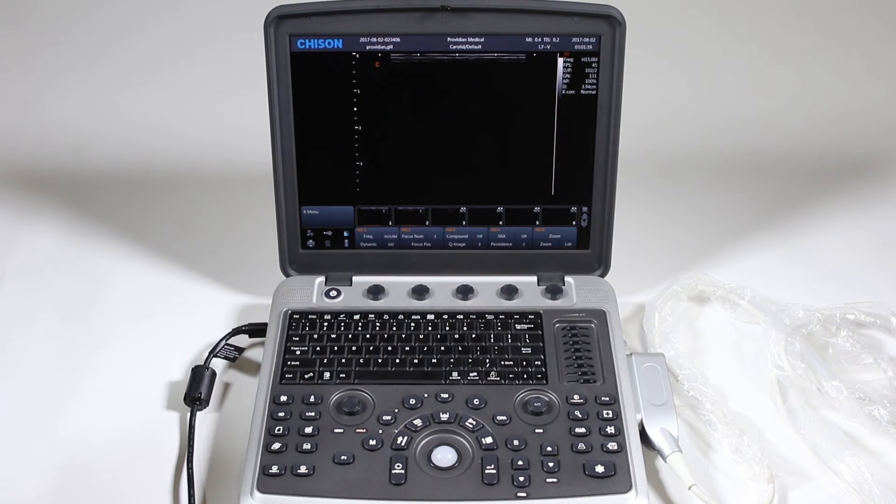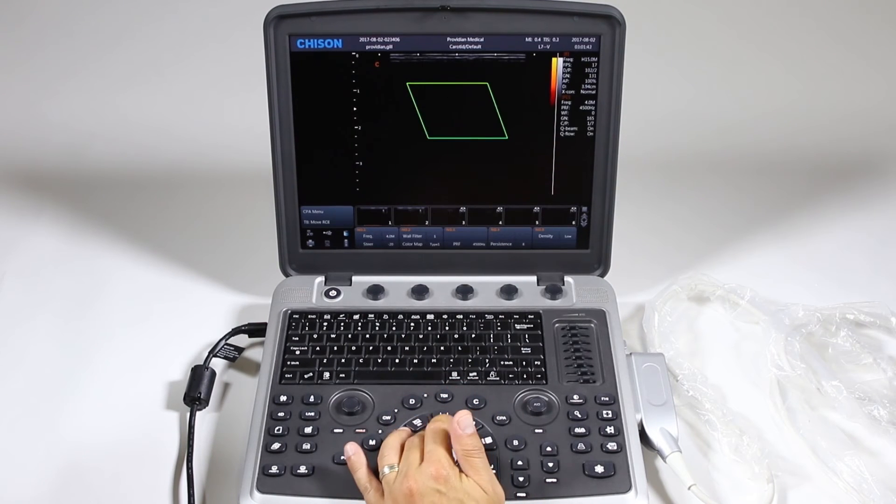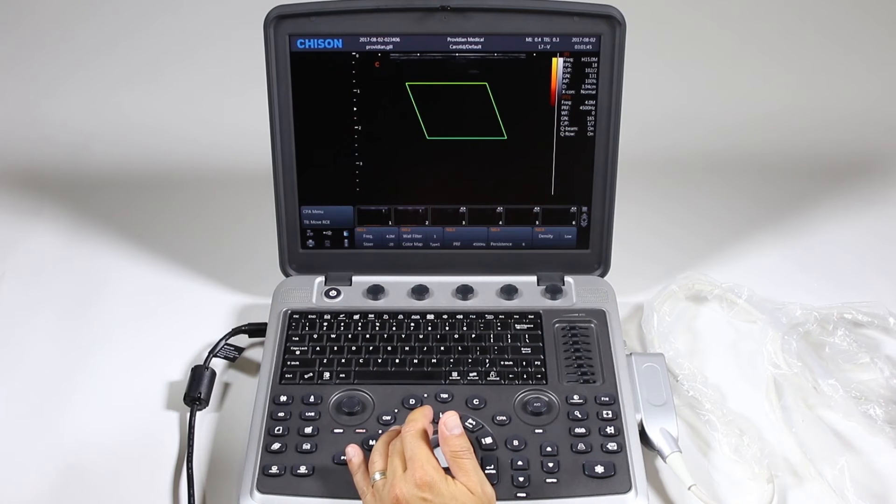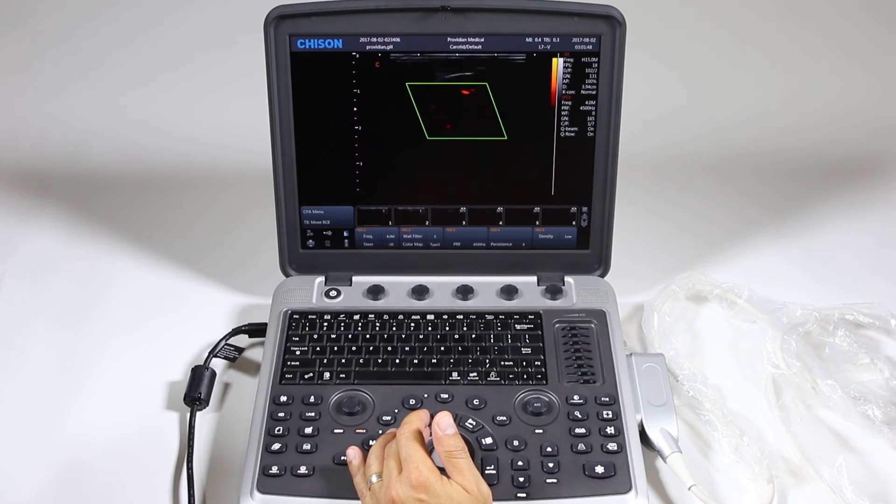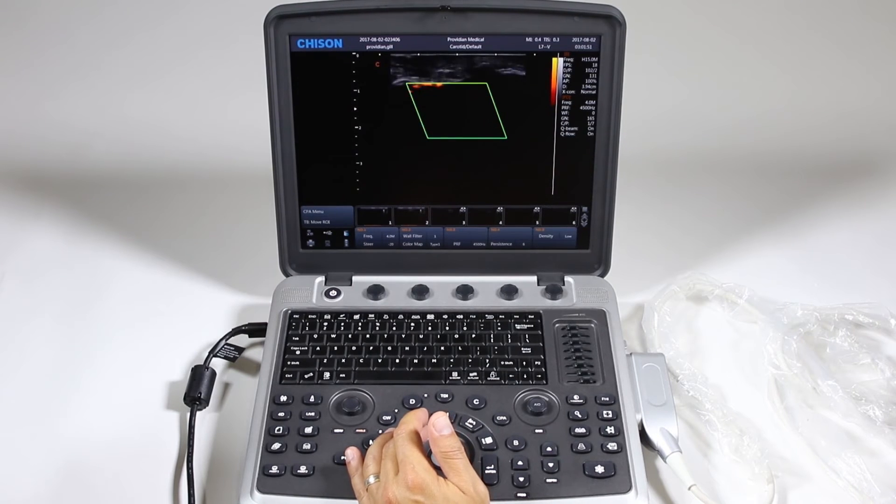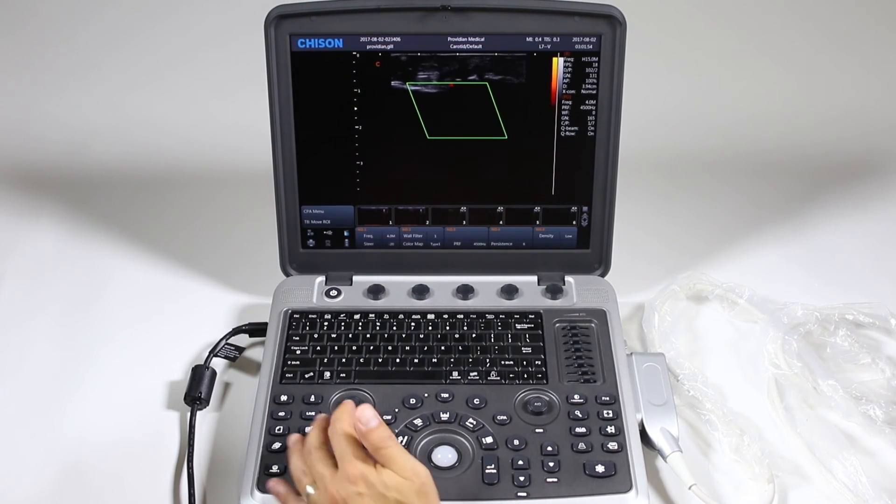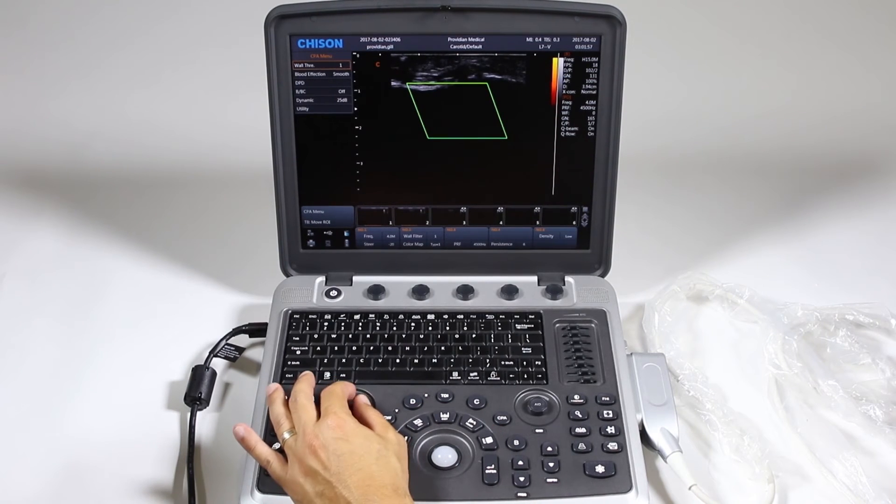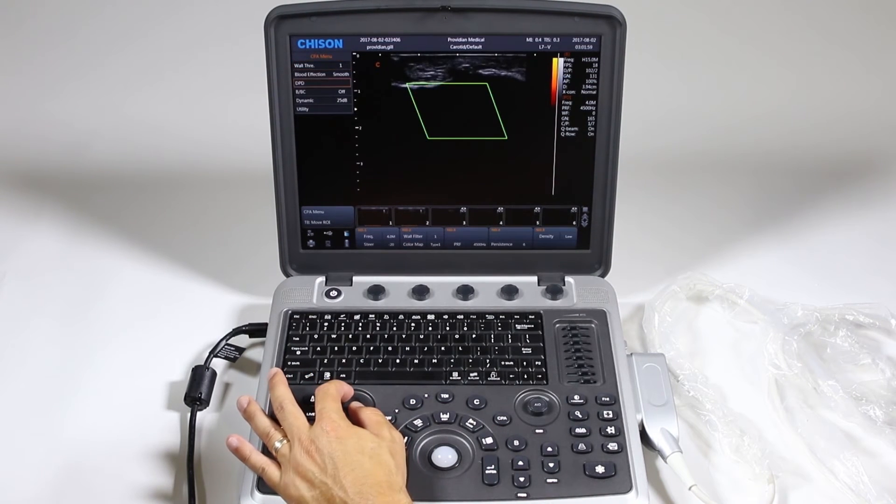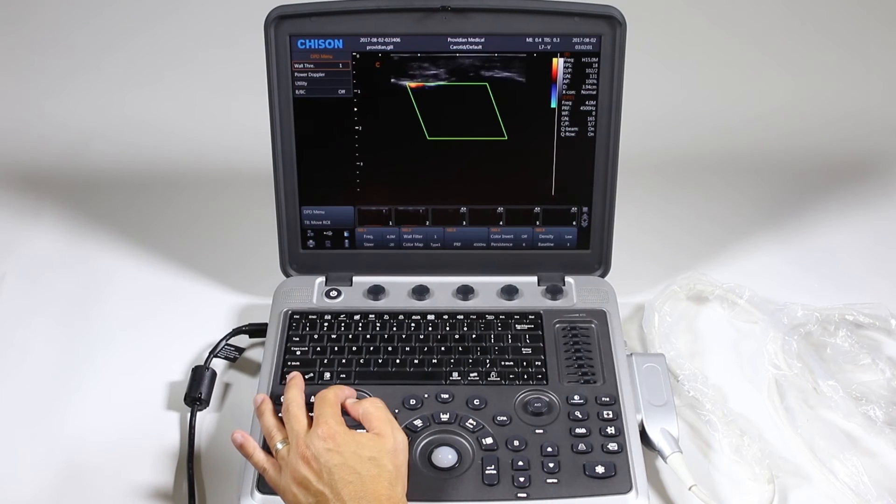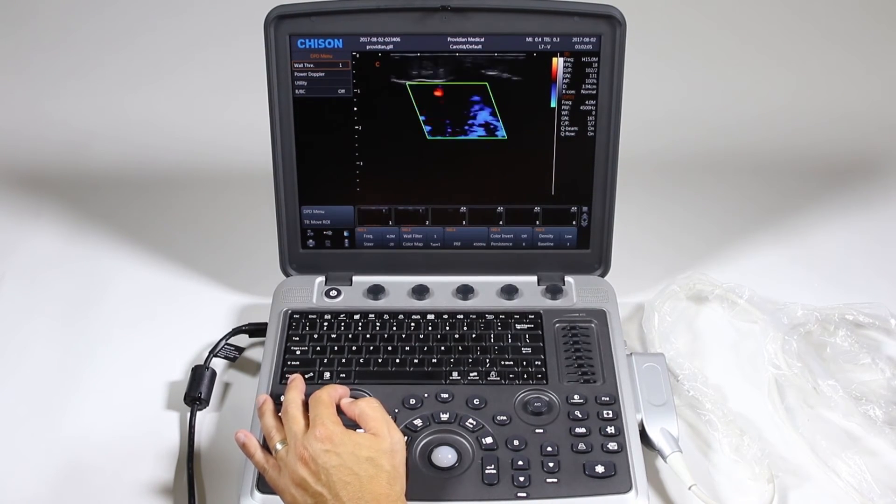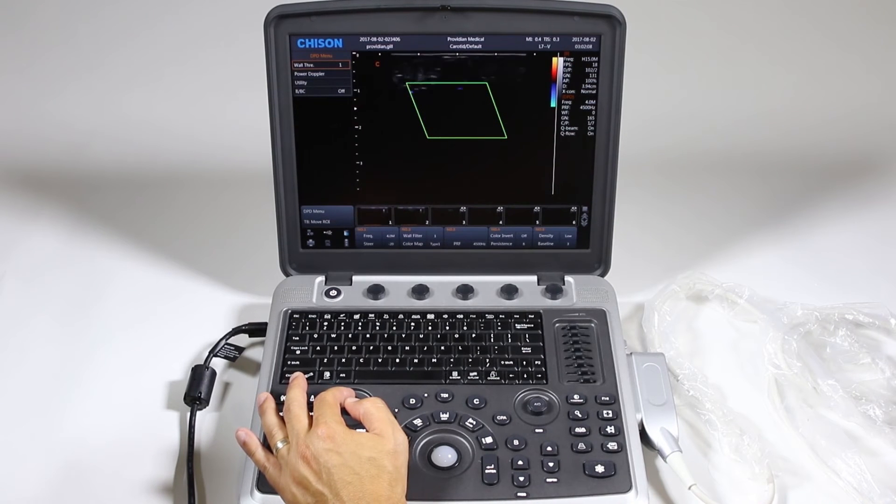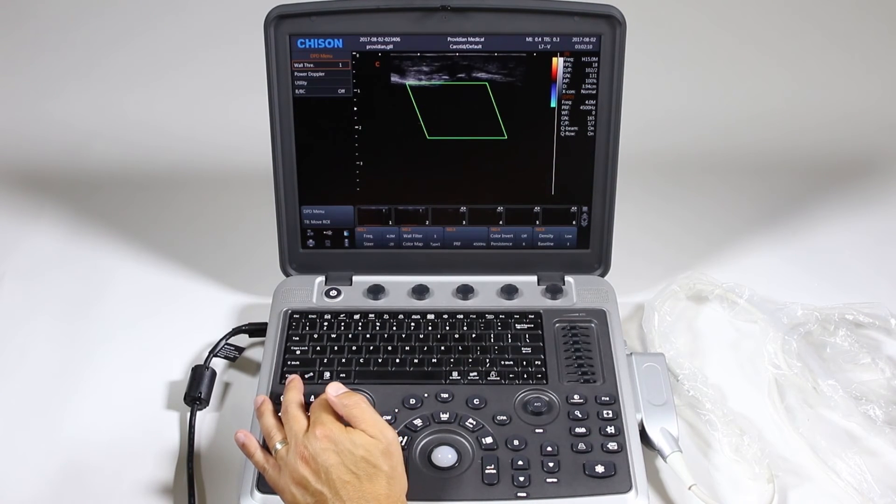Now color power angio works very similarly. You just hit CPA and you have your box and this is just going to show you cellular movement. Now that's all just one color and it's not giving you any directional information or velocity information. And same thing, if you hit menu here you can get what's called directional power Doppler, which won't give you any velocity information, but it's going to show you blue and red.